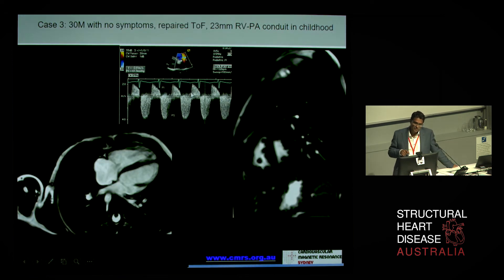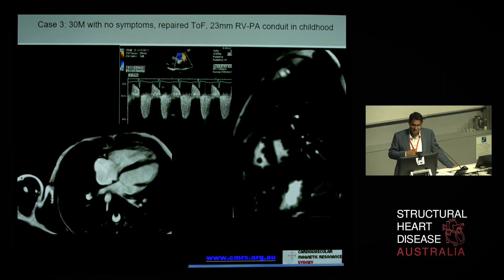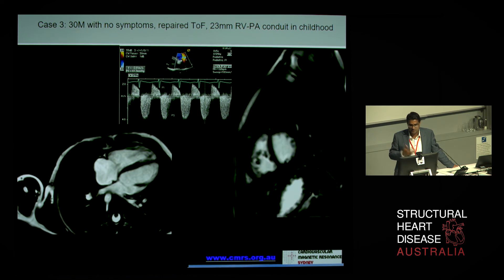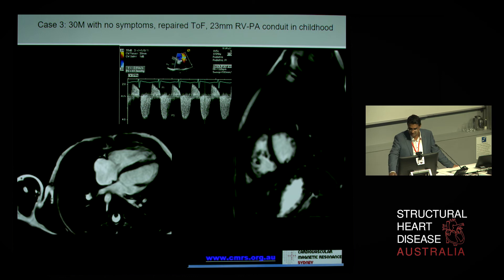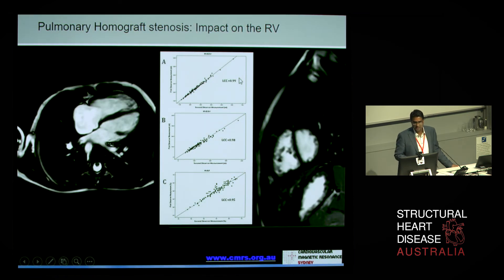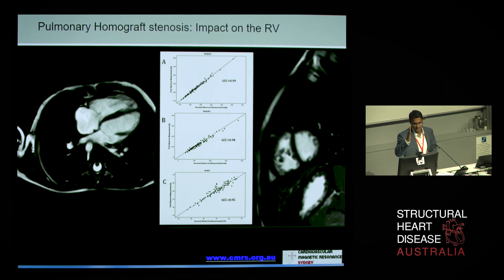This case is a 30-year-old patient who says they have no symptoms — though as is often noted, a lot of these patients with some sort of valve problem do very little exercise and complain of very little. The case notes say a repaired Tetralogy with a 23-millimetre conduit placed between the right ventricle and the pulmonary artery. What you see is a lot of pressure load on that right ventricle — septal flattening indicating pressure load and a wobble in diastole indicating volume load as well.